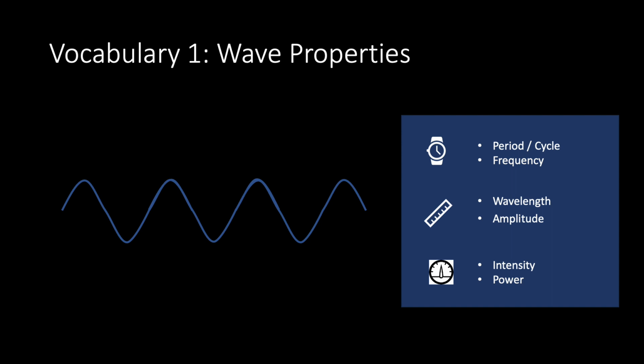Now we can also make a measurement of the displacement of the particles as the wave travels. So on this wave, we would measure from the top or the crest of the wave down to the trough or the bottom. But remember that this is a transverse wave that's depicted here on the slide, and that ultrasound waves are longitudinal waves. And so amplitude, while it is a distance measurement, really doesn't give us the full picture of what we need to understand about ultrasound waves, which is more going to be covered on the next slide when we talk about intensity and power.